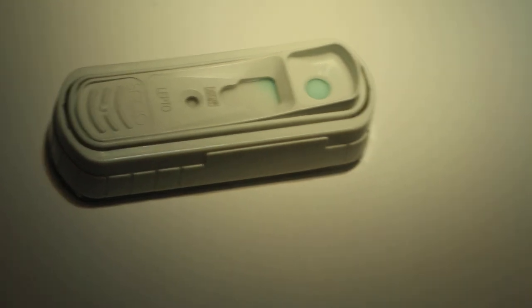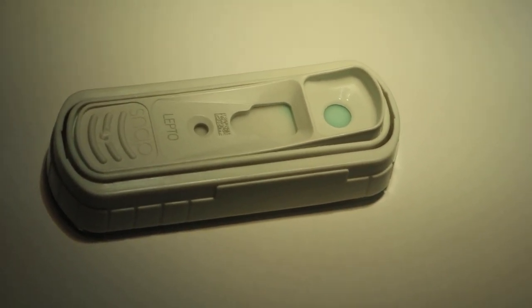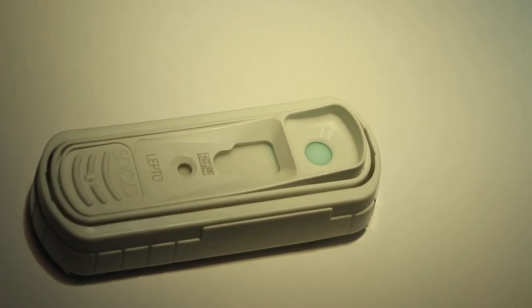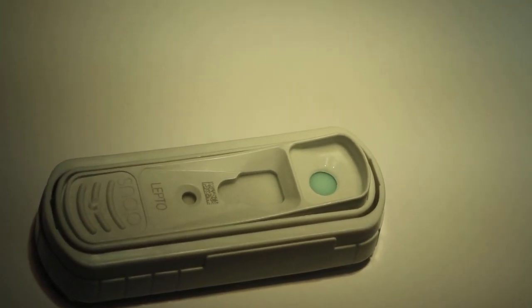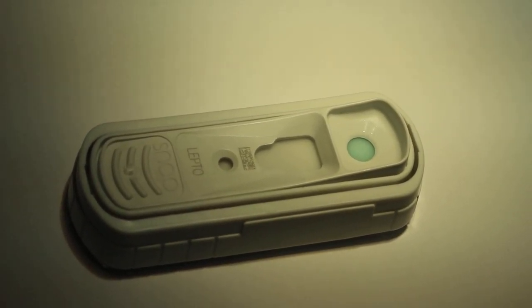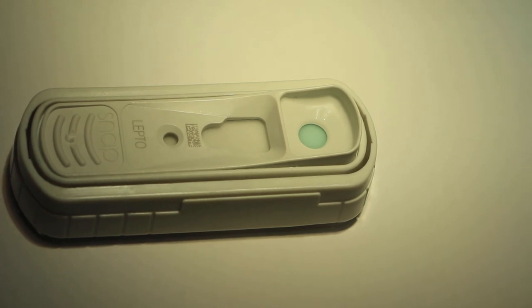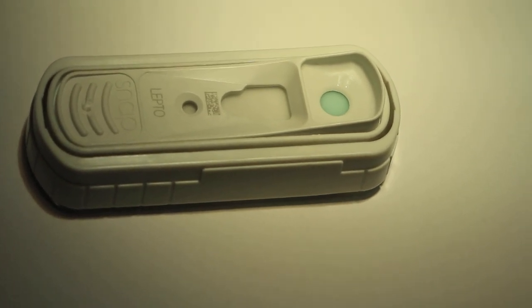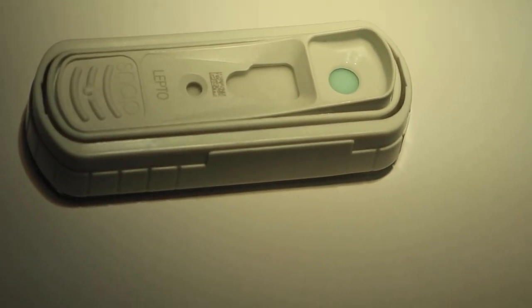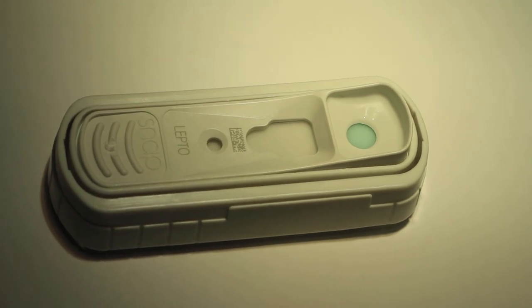As you can see, the sample spots have disappeared — the blue. There were two blue spots, but now there is nothing, no blue color. Although originally you can see two blue spots before we put the conjugate and sample in. We have to wait 10 minutes.